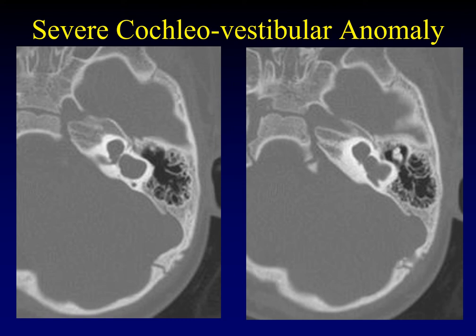Next we get into a vague area encompassing much of this spectrum that we call cochlear vestibular anomalies, graded as severe, moderate, or mild. In this situation, it looks a lot like a common cavity, but you can make out that there's going to be a cochlea anteriorly and a vestibule posteriorly. You can see the shape of the lateral semicircular canal and a posterior semicircular canal — there are bits and pieces, but the blob is divisible into different parts. This is a severe cochlear vestibular anomaly.